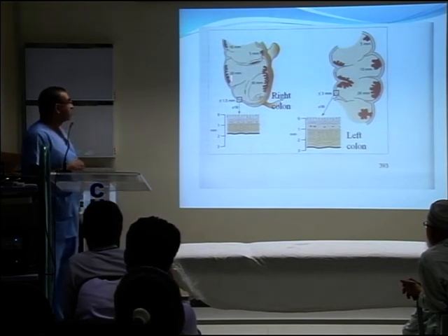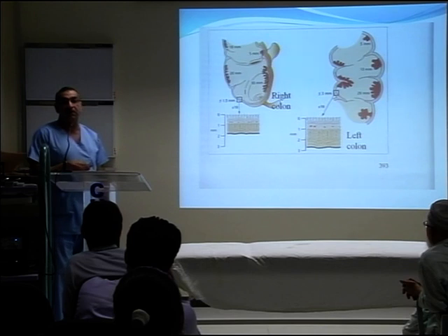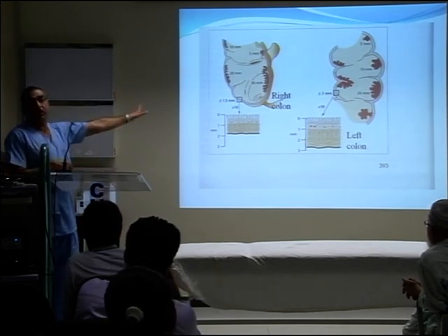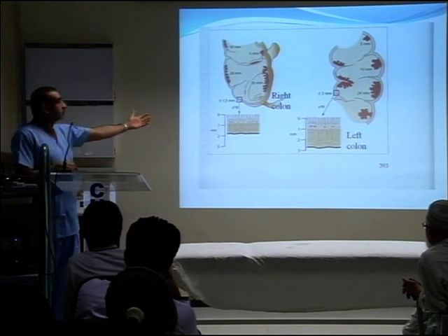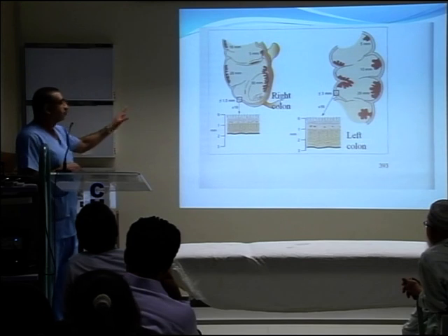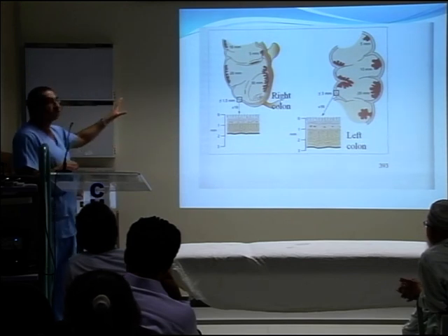So whenever you are doing any polypectomies, any EMR, I do lots of EMR on the right side, but we do it safely. We inject fluid under the flat polyp and remove it, and it's not a problem. But always treat it with respect. Never give excess amount of current there.